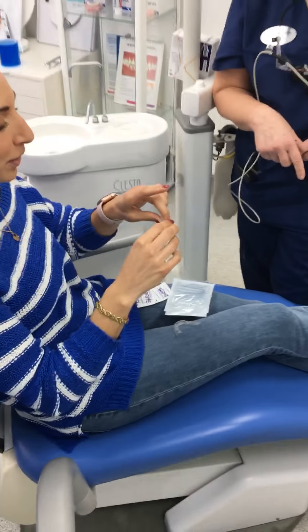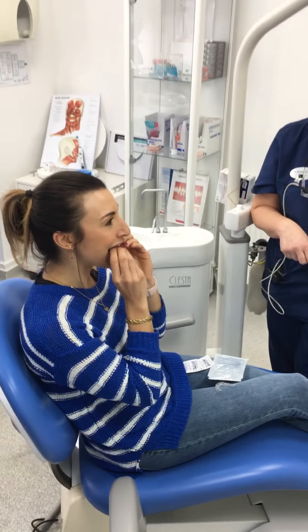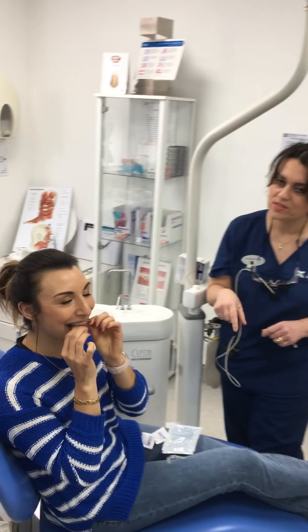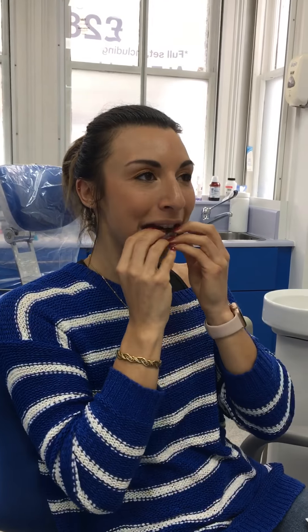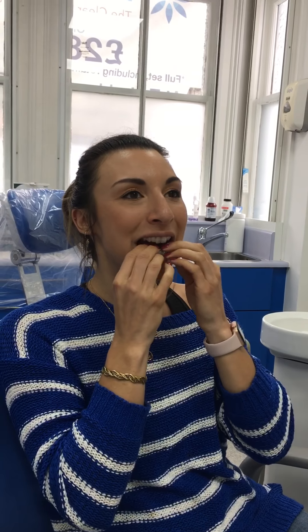If you want to just come forward so you can see — did it click? Excellent, brilliant, you're a natural! So put the little one in as well. Lovely.